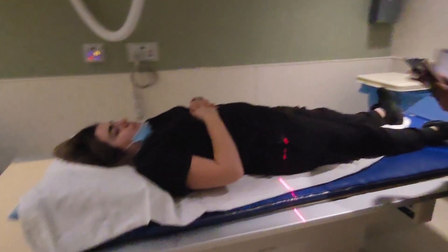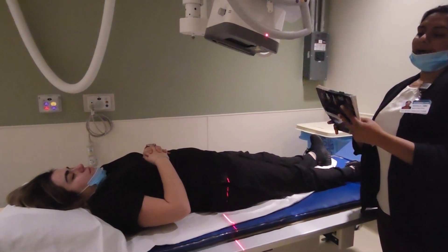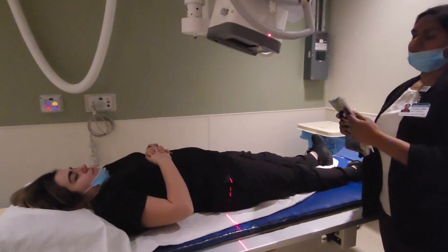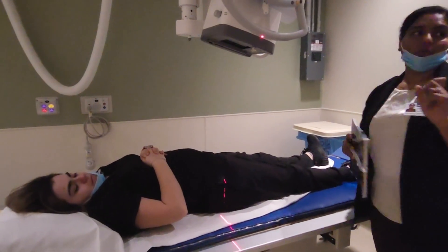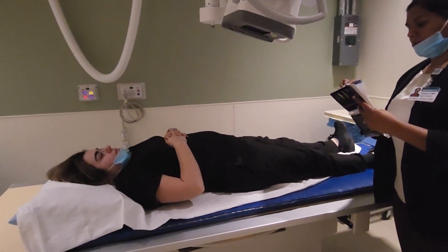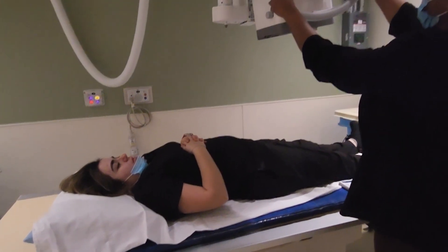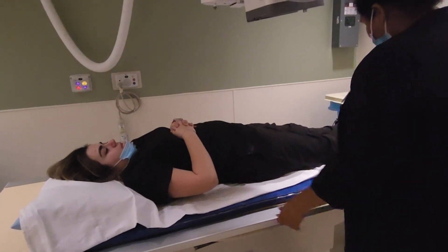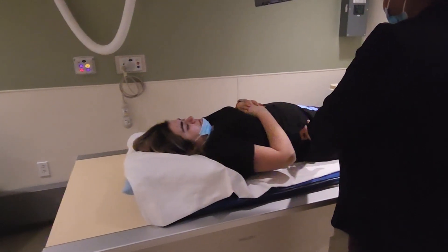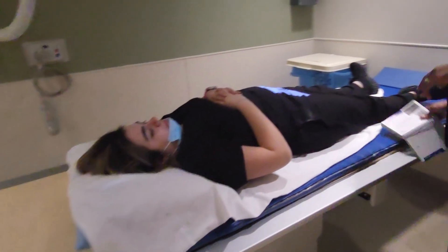So that was our AP sacrum. In the book, sacrum and coccyx are listed separately, but 90% of the time you're going to do the lateral sacrum and coccyx in one shot because everything's right there. For the AP coccyx, the angulation is 10 degrees caudal. Centering is two inches below the ASIS. So 15 for sacrum, 10 for coccyx — the centering is the same for both: two inches below the ASIS. The only difference is the angulation. Collimation is eight by ten for both.